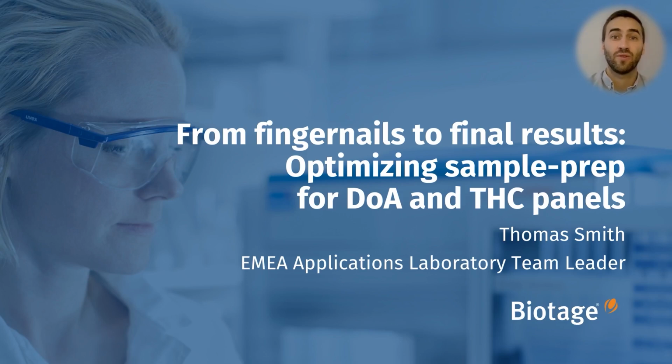So today I'm going to run through a couple of application notes that were developed in-house by our R&D team here in Cardiff. They use the full Biotage analytical workflow solution. Both application notes are using fingernails as the matrix, one of them extracting a large panel of DoA and the other a THC panel. As well as I've got a few tips and tricks to use when analysing for DoA and THC.